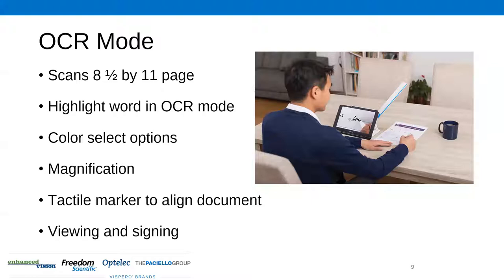Also worth mentioning is the Bluetooth capability. If you're in a classroom or a library and don't want people to know what you're listening to, you can connect this to a Bluetooth headset. It also has an audio jack if you're still using auxiliary. On the reading functionality — you can change from a single line of text, to just text, to live view with highlighting on the image. That flexibility is nice, especially for users who may have reading and writing issues in addition to low vision. Cutting down to one line of text makes it less intimidating and reduces the anxiety of having to read a full page.